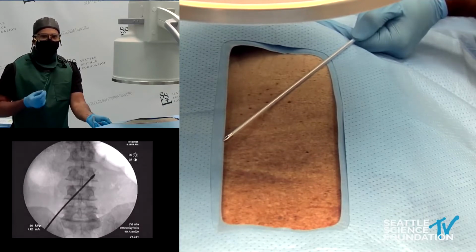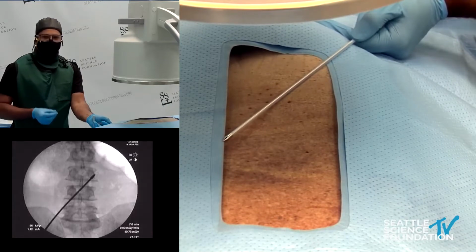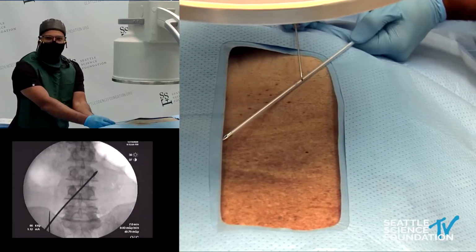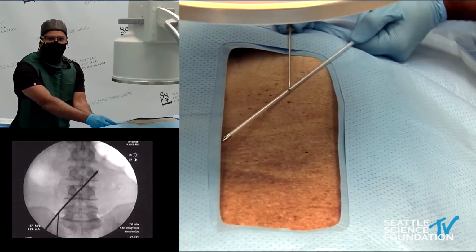So I really encourage you to be kind of perfect the first time around. So really draw this out. I don't have a marker with me, but I encourage you to do that in the OR. So what I'm going to do is just find my needle skin entry point.